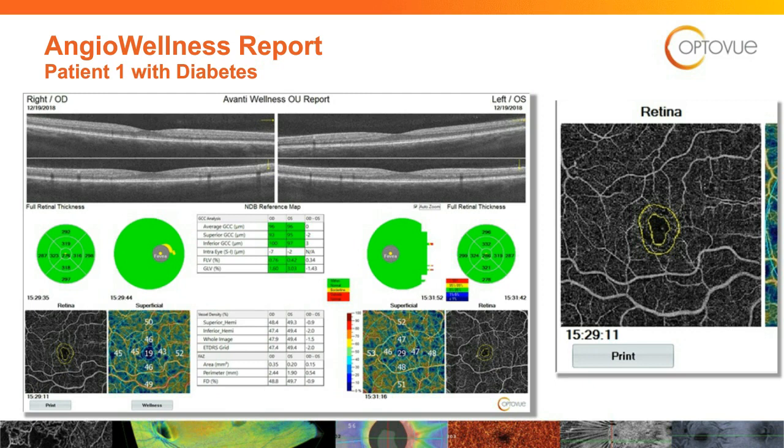And then if you look between the 2 yellow lines, I guess on the temporal side, you'll see a little dropout. And so this is a patient that comes in, and we would dilate them, see no dot hemorrhages, blot hemorrhages, exudates, so on and so forth, and we think that they were perfectly fine, and we're picking up diabetes and vascular changes at the highest level here that we can pick them up, and coaching the patient.